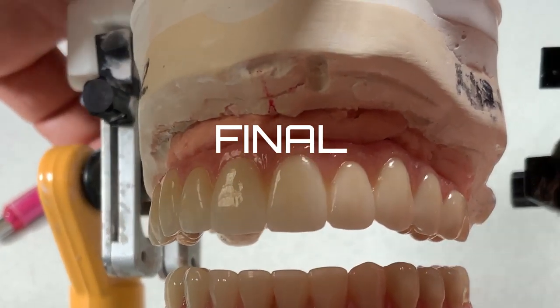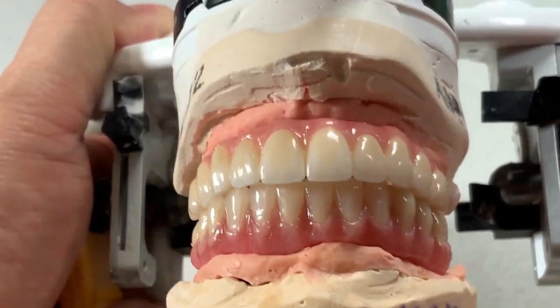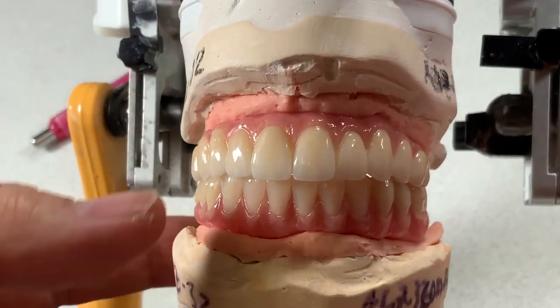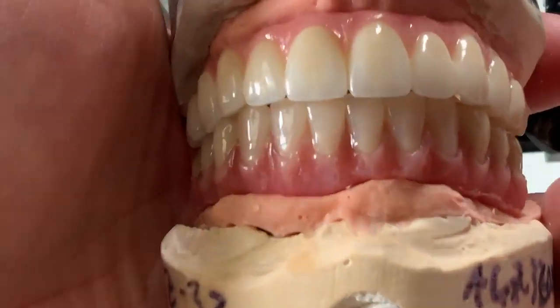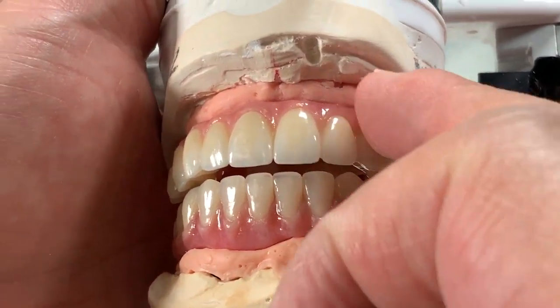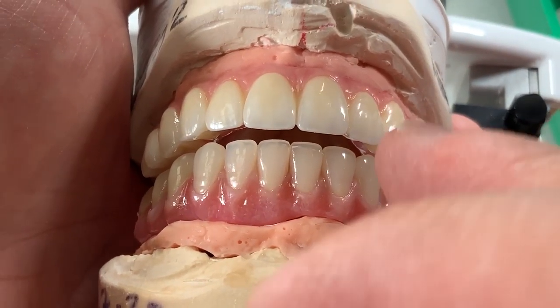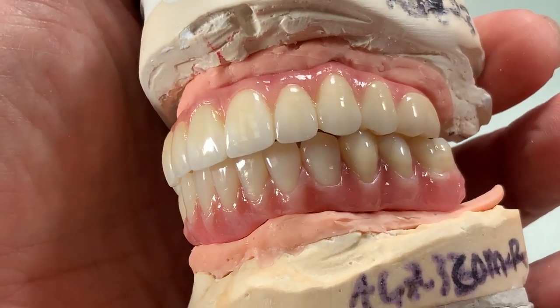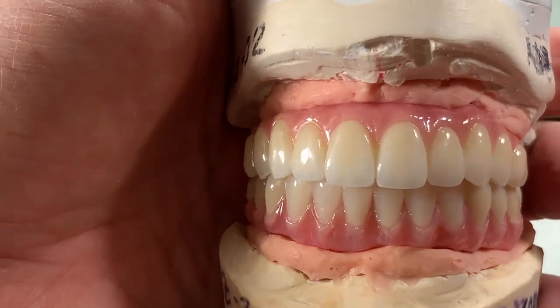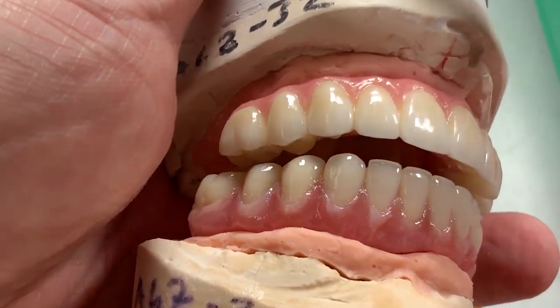Here is another great combo, beautiful cases. We call it Cyton 4500 and the lower Cyton 3000, which means the zirconia layer basically. And here is the screw retained hybrid acrylic. Okay. So that one's aesthetics beautifully done.